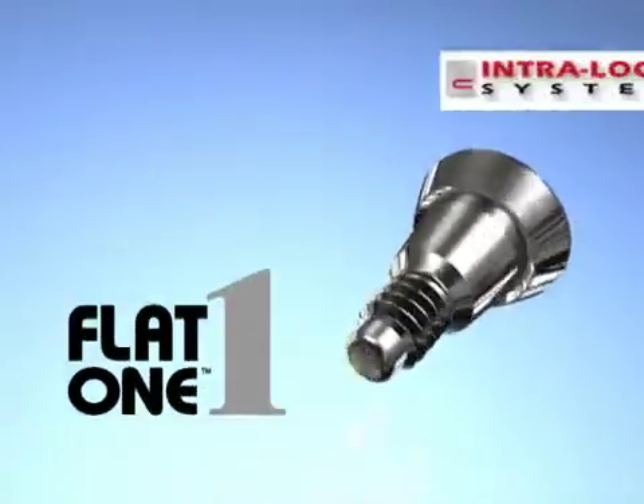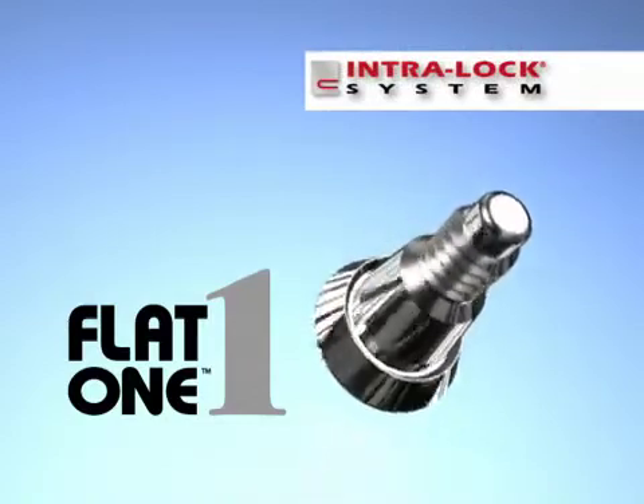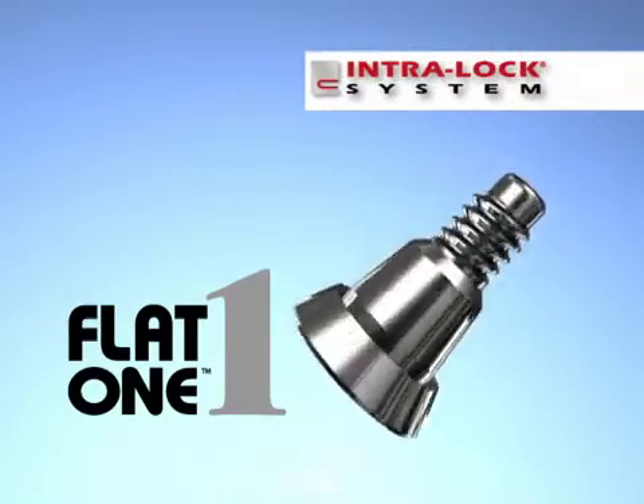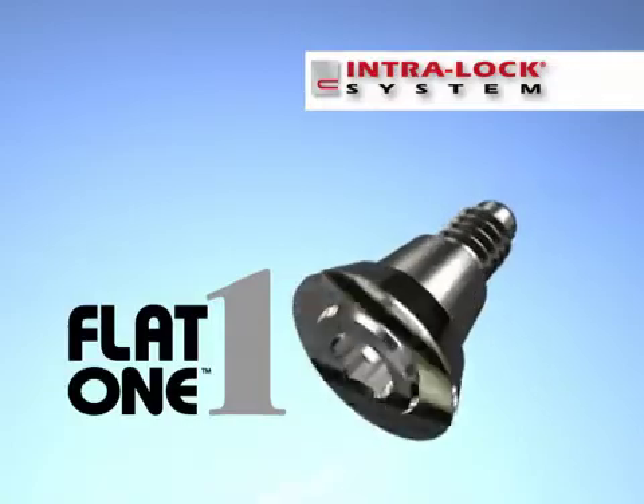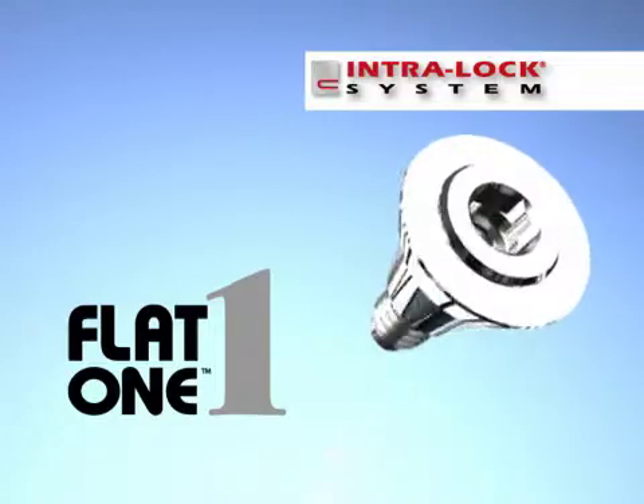Intraloc's Flat-1 abutment system is designed for full mouth rehabilitation cases or clinical situations that require cross arch splinting. It eliminates the need for parallelism and is ideal for bar cases and screw retained bridges.